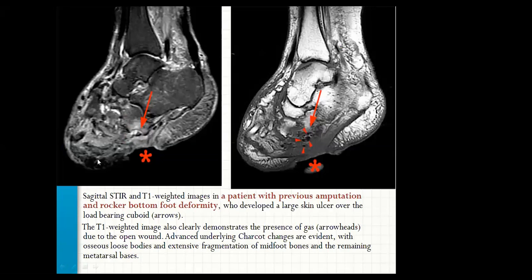This MRI image shows STIR and T1-weighted images in a patient with a previous amputation and rocker bottom foot deformity who developed a large skin ulcer over the load-bearing cuboid. The T1-weighted image also clearly demonstrates the presence of gas. Due to the open wound, advanced underlying Charcot changes are evident, with osseous loose bodies and extensive fragmentation of the midfoot bones and the remaining metatarsal bases.